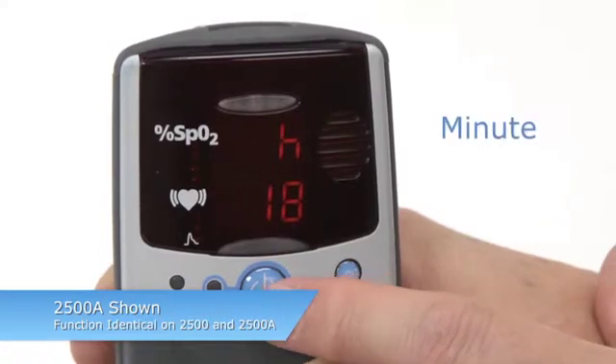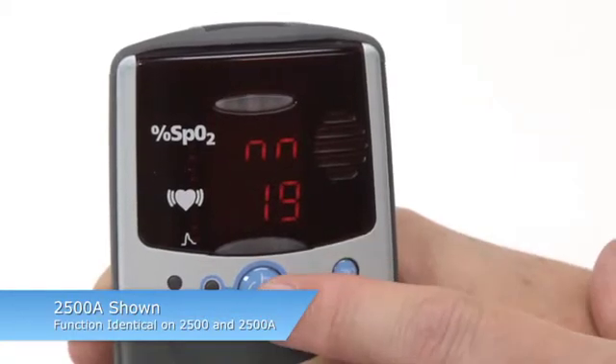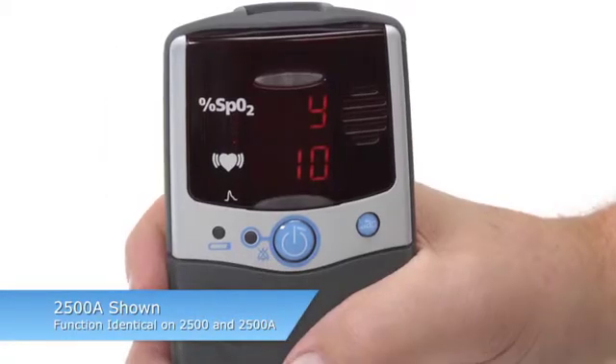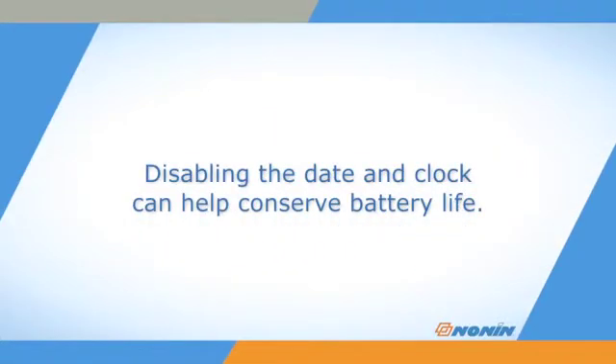Once you set the minute value for the clock, you will exit Setup Mode. You can disable the date and clock settings by setting the month at 00. If you confirm that setting, you will immediately exit Setup Mode. Disabling the date and clock can help conserve battery life.